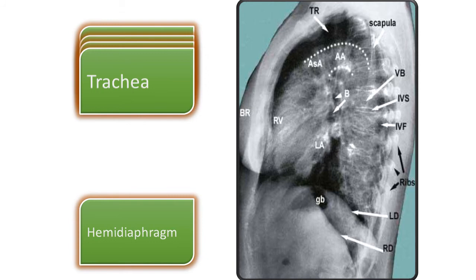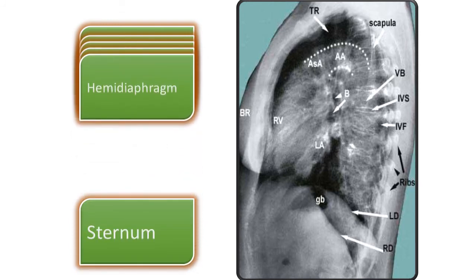In the lateral view you can see lines labeled LD (left diaphragm) and RD (right diaphragm). The fundal gas, which lies under the left hemidiaphragm, helps identify it — the fundal gas will lie just under the left hemidiaphragm. The sternum is the bone anterior to the chest, and we also have to assess the retrosternal area and the xiphisternal junction.